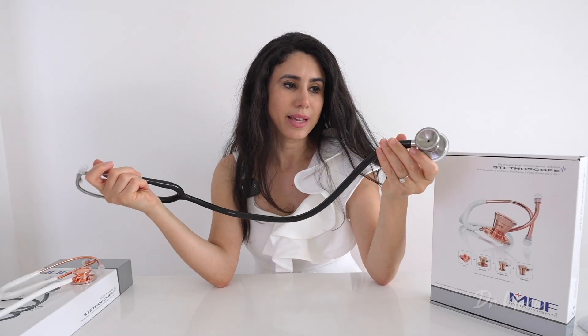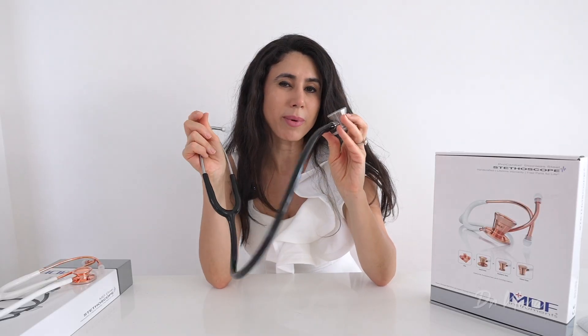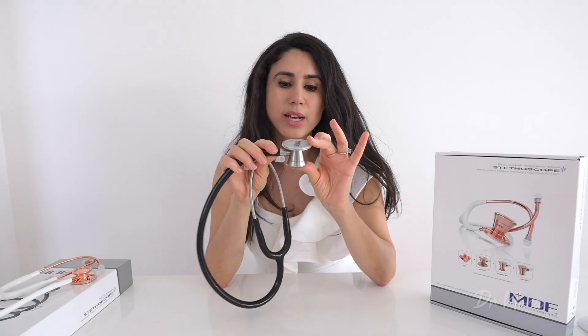Looking at the aesthetics, it does come across as being a little bit heavier than my Littmann Classic 3, which is a general diagnostic stethoscope. This one is primarily for cardiology, and the reason it's weightier is because of this chest piece. It feels quite nice being heavy because I feel like it might give me some good amplified sounds.